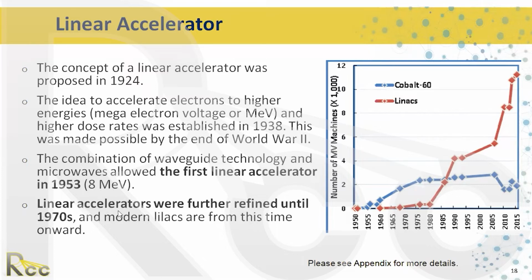So in 1970, when I started working in radiation therapy, we had the Varian Linac 4, and it was a very modern linear accelerator at that time. And it produced an energy of 4 million volts equivalent. The reason the linear accelerator was popular and was able to be developed was because of microwave technology. So instead of a radioactive source, such as cobalt, instead of an X-ray tube like a Coolidge tube, the radiation could actually be produced by using microwave as the accelerator for the electrons.